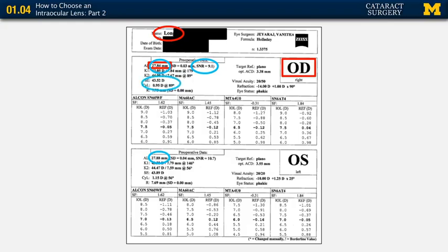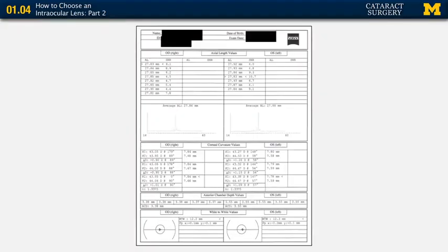If we then move on to looking at the keratometry for symmetry check, we see that also is okay, roughly about 43.5 diopters. We're falling within our mark of 1 diopter. And although the axis is not really quite following the enantiomorphism discussion we had, here we don't really have a very high level of astigmatism, and we're also not correcting for astigmatism, so we can kind of overlook that at the moment. Moving on to the second sheet of our IOL Master calculation, here we can get into more in-depth discussion of the quality of the study.